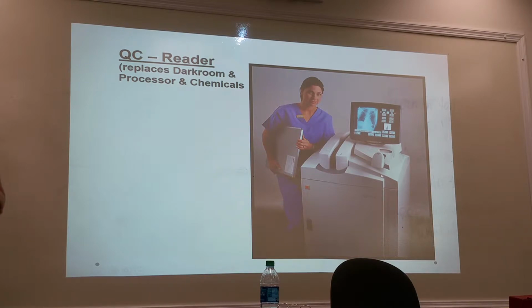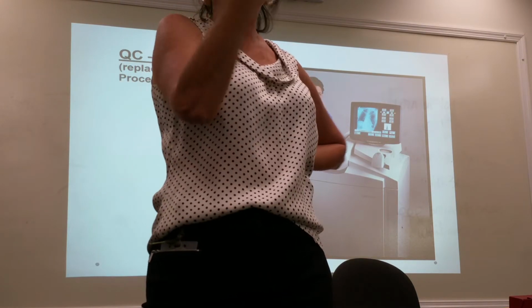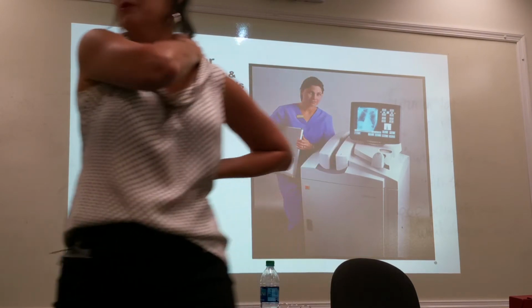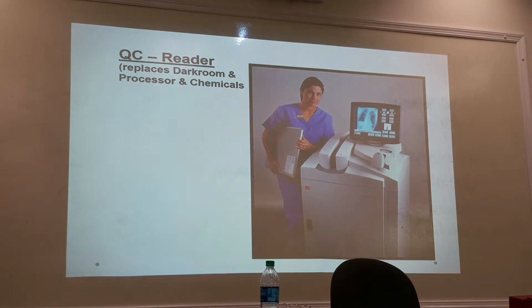Okay, so as I was saying, St. Jude was one of the first hospitals to convert to CR in this area, affiliated with us. And I asked the director at the time, what was it that propelled him to do that? Because it was very expensive. And we have read studies, controversial studies, saying that not having to pay for film, not having to repeat, not having to buy processing chemicals and stuff like that, offset the cost of CR. And it didn't. He said it absolutely did not. So I said, well, then why did you do it? And he said, because that's what our patients expect. The patients were demanding that.